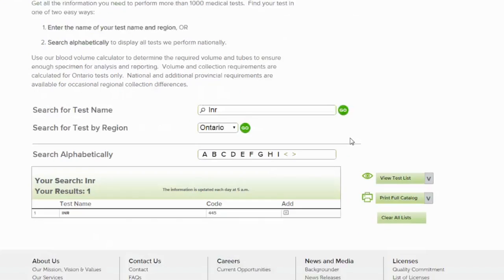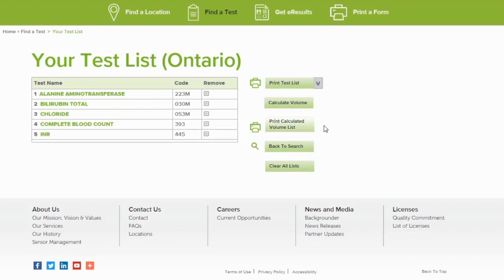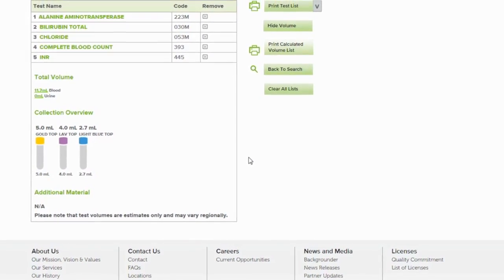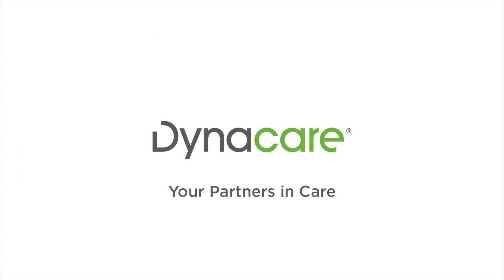Once you have added all the tests you are interested in, click on the view tests list, choose Ontario, then click on calculate volume. This will display all the tests in your search, the total volume required, and the collection overview. Please refer to the information in your kit and should you have any additional questions, please reach out to us.